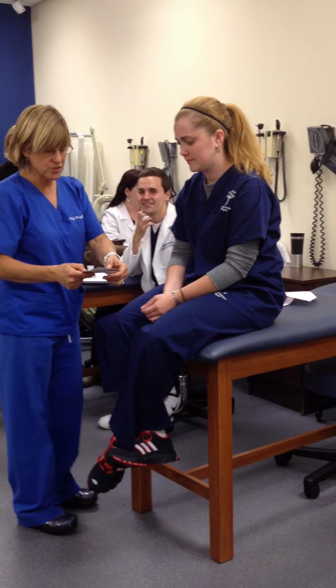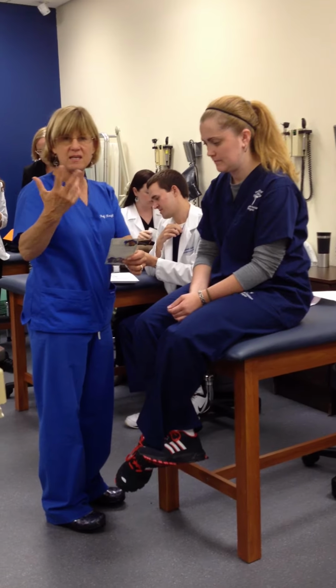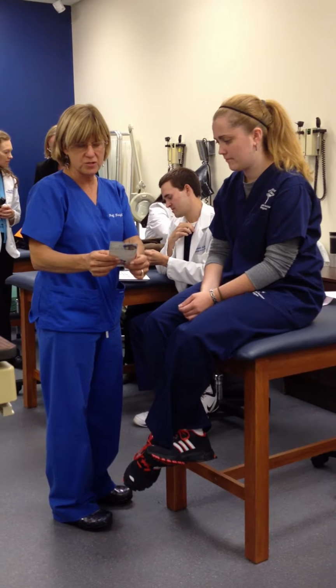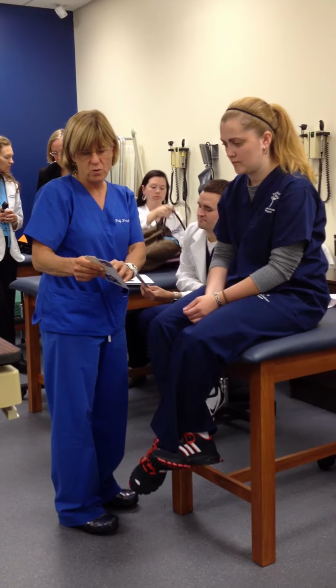On your cards, you'll see there's numbers. If they can read the numbers, great. If they can't, you can look at the E, or some of them are U's, but the E, which way it's going, and then there's X's and O's. And then if you look all the way across, you see what the vision was.